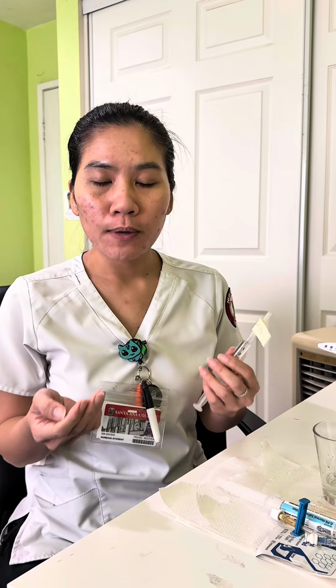Hi, today I'm going to perform the IV push with saline lock. The medication I'm using today is metoprolol, 5 milligrams over 2 minutes. After verifying with the patient and the doctor's order, I'll go ahead and draw the medication.